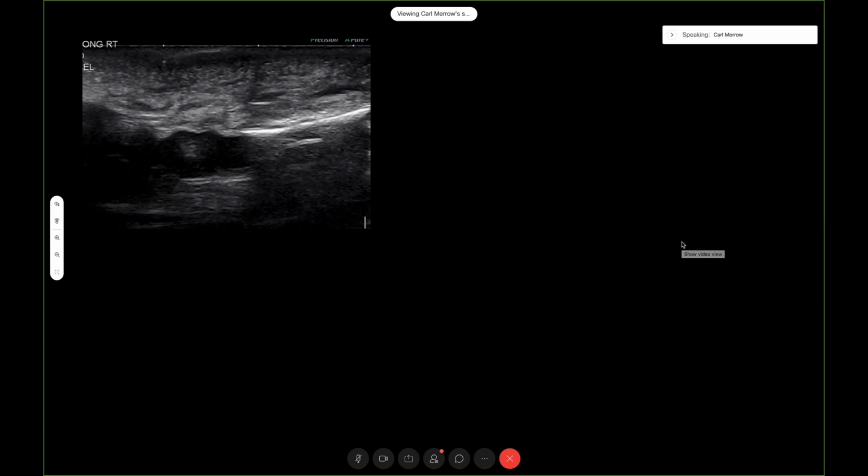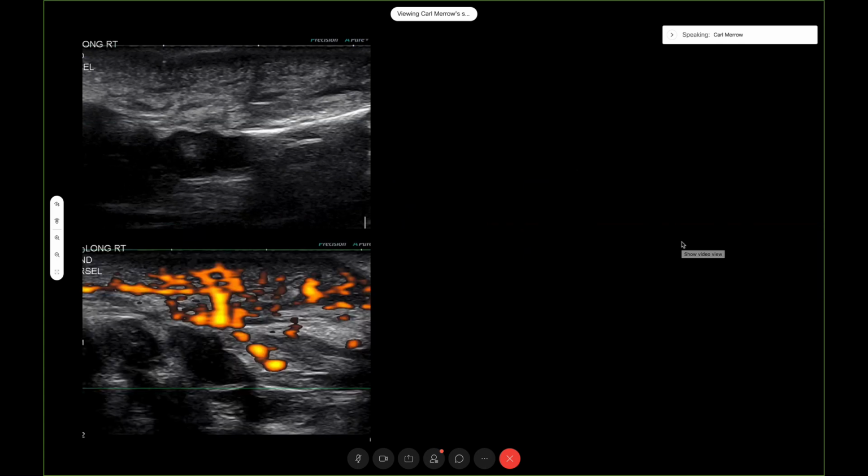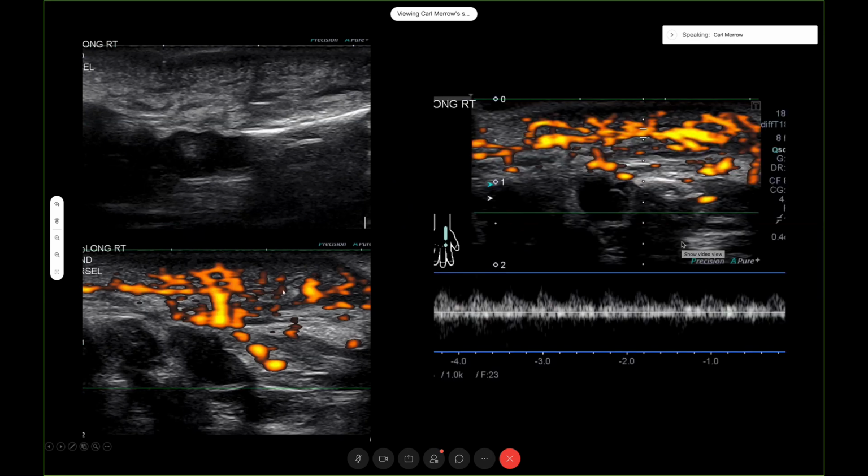And you turn on, and this is one of the things I always want to know from our technologists and from the clinicians too: is this soft and squishy or is it firm? And it really did not compress. So turn on power Doppler and this thing really just lights up. Put on some spectral tracings, and I always ask our techs to sample at multiple areas through the lesion, not just turn on color Doppler, but give us several spectral tracings. And so there were a number of low resistance arterial waveforms, also some venous waveforms scattered throughout the lesion.